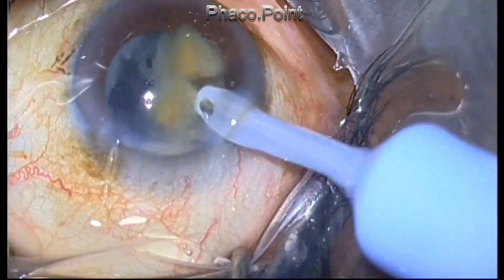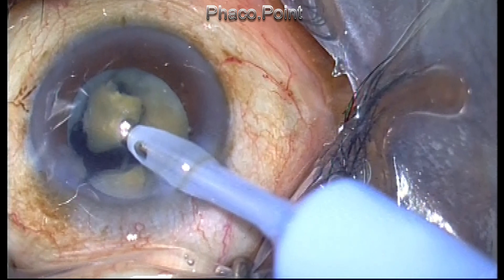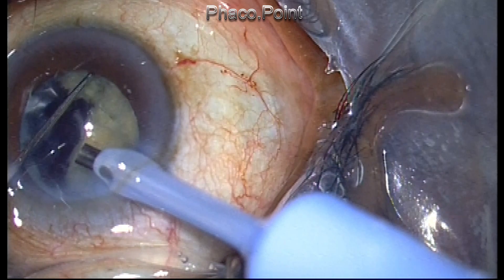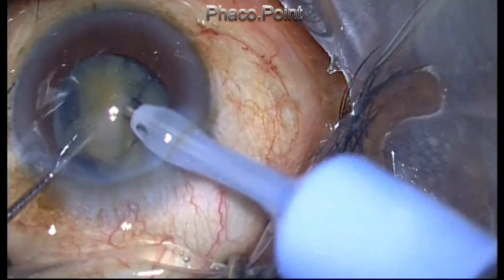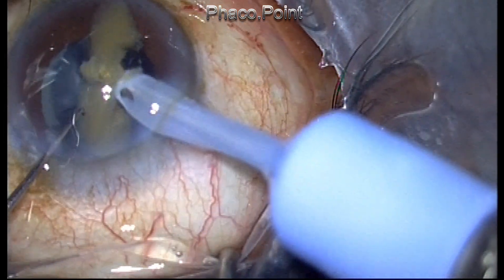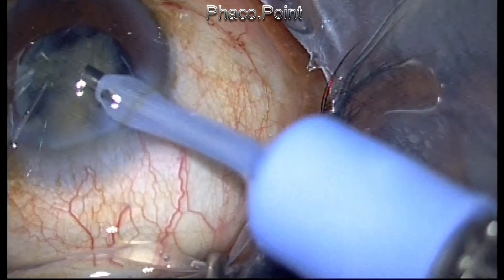Once I have created the chop, I switch to a Sinskey hook and remove all the quadrants — about six in this case. Staying within the center and applying a judicious mix of phaco power and vacuum, I am able to get the pieces emulsified right in the safe zone, which is in the dead center of the eye.